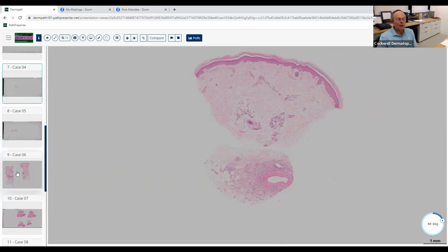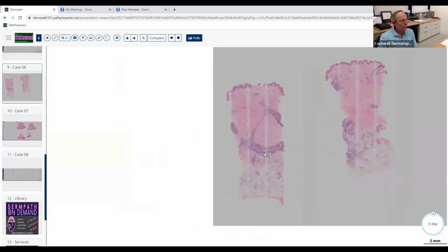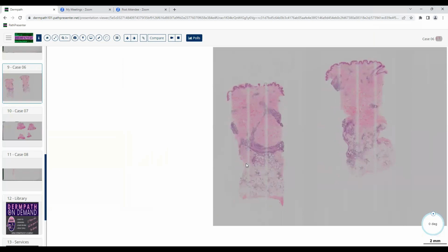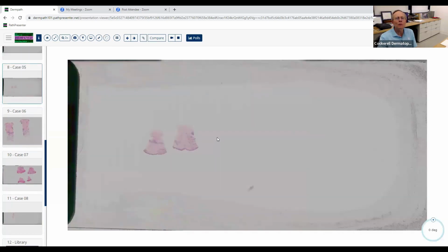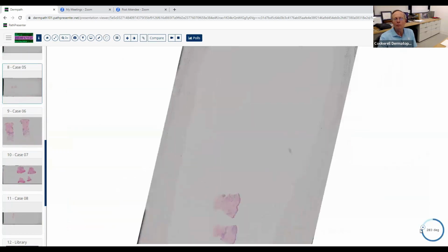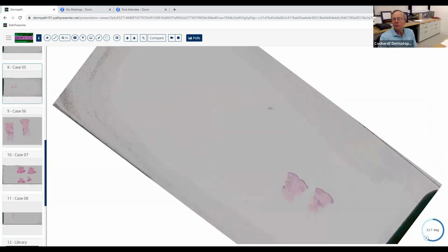Okay, great. Very good. All right, let's do this one. I can get this one. We're looking at a punch. I think I missed. Let me go back up. I think I need to do this one first. Yeah, let's do this one. I skipped one. I can take this one, Dr. Cockerell. Okay, good. Sorry about that.